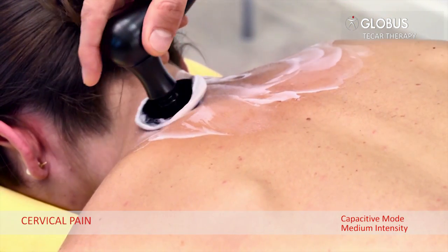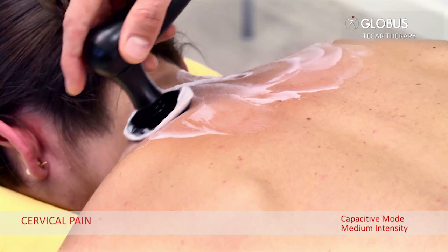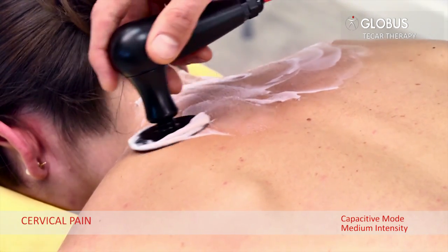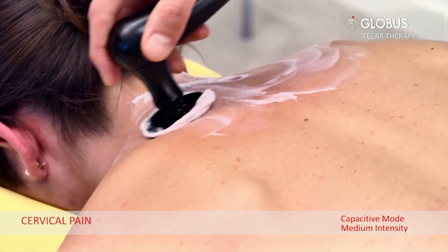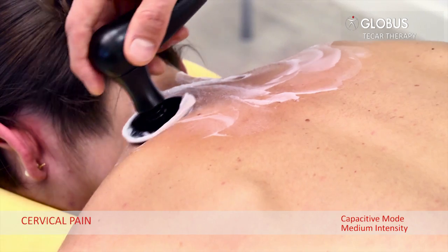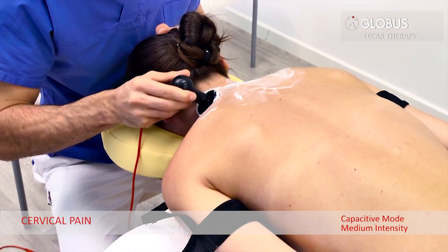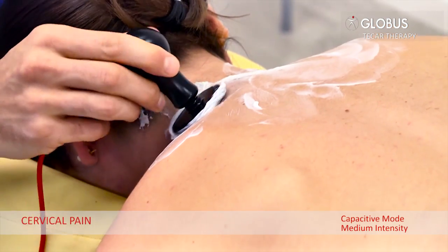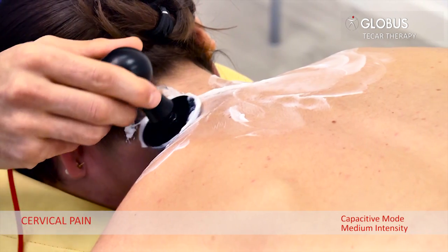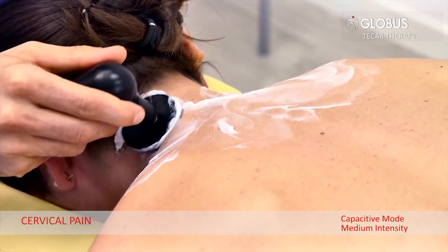For a first treatment, we can treat the muscle functional overload — typically stiff and sore muscles — such as the upper trapezius, the levator scapulae muscle, and the cervical paraspinal muscles.